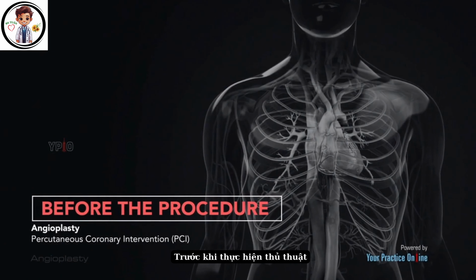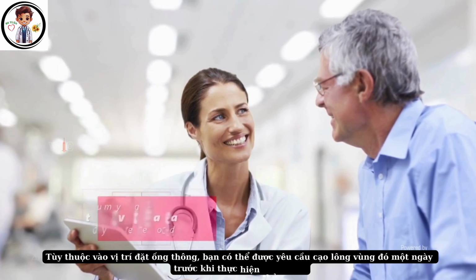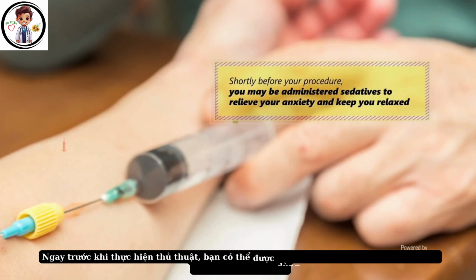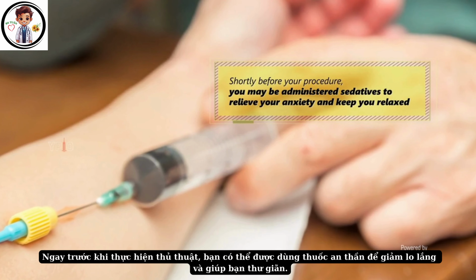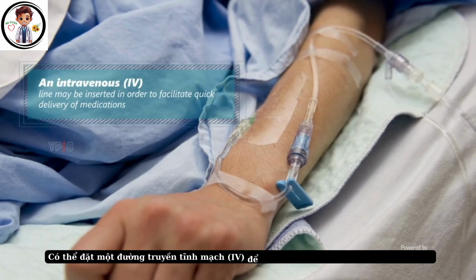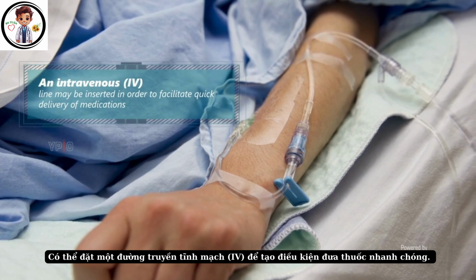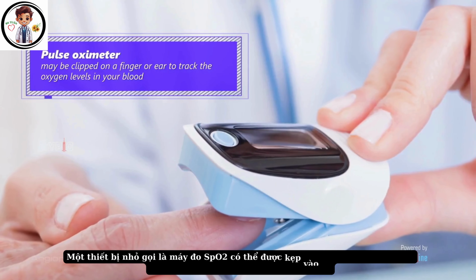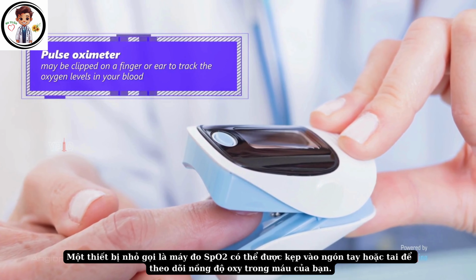Before the procedure. Depending on where the catheter will be inserted, you may be asked to shave the area a day before the procedure. Shortly before your procedure, you may be administered sedatives to relieve your anxiety and keep you relaxed. An intravenous IV line may be inserted in order to facilitate quick delivery of medications. Electrodes are placed on your body to monitor your heart. A small device called a pulse oximeter may be clipped on a finger or ear to track the oxygen levels in your blood.